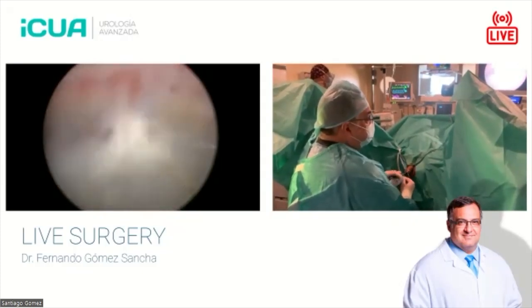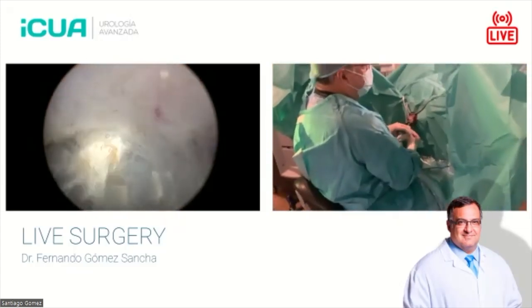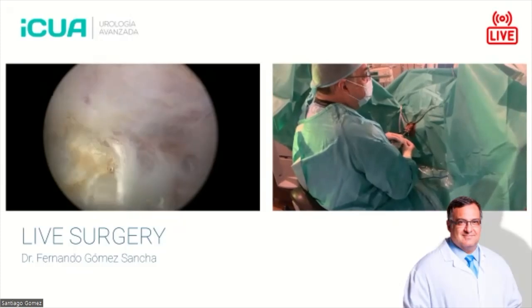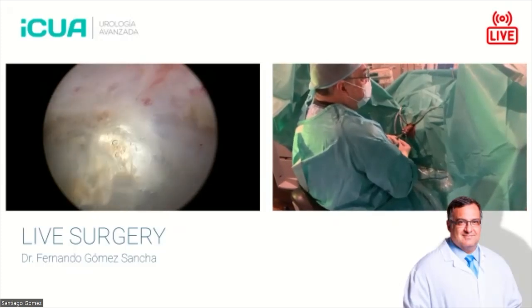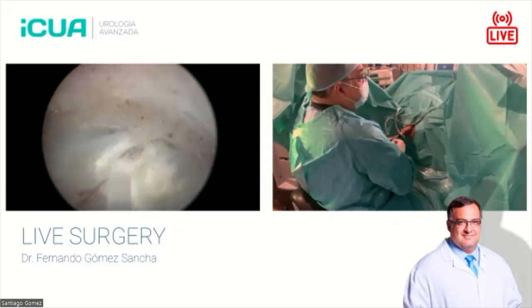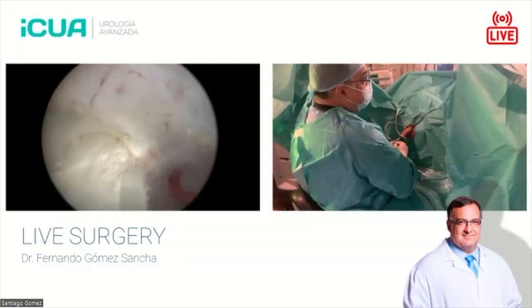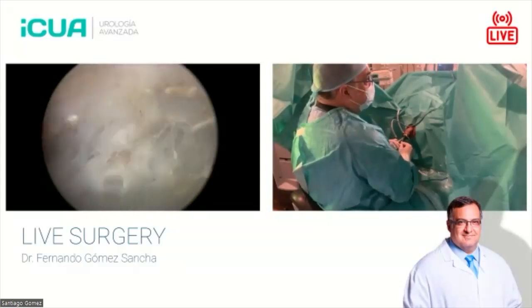The second factor, as I said, is the speed of movement. I can choose to have a very slow movement, like this, and that will give me very good hemostasis. Or I could go a little bit faster. And of course, that will give me faster dissection, but maybe hemostasis might be compromised if you go very fast.